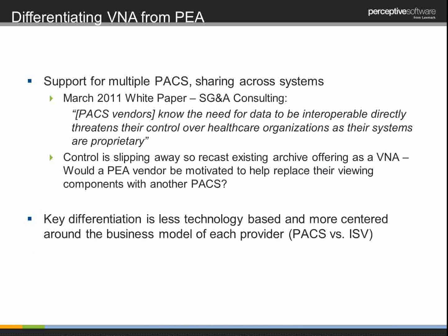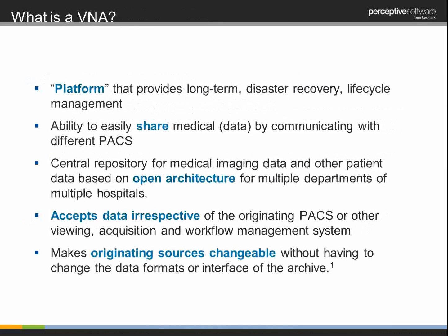So what really is a VNA? This is a definition that I pulled from a report generated by InMedica in 2012. I like the way this definition derives a number of core attributes around what a vendor-neutral archive is and how it needs to be providing certain capabilities to the customer without getting into really gory details around the technology. Technology is important, but I think the business case for how customers go about this differs, and so the VNA needs to be defined broadly.